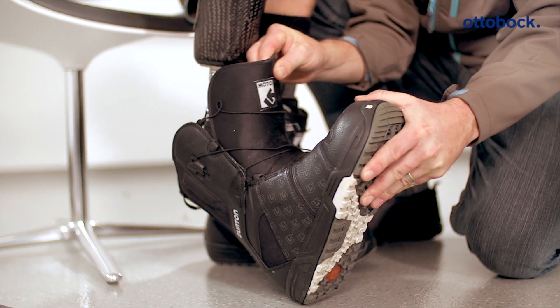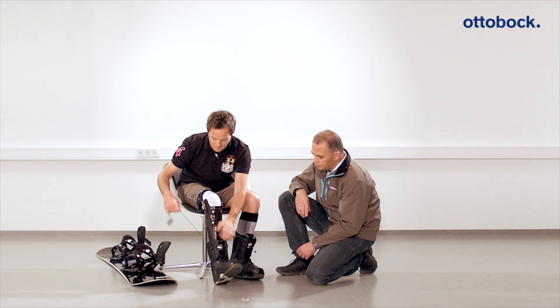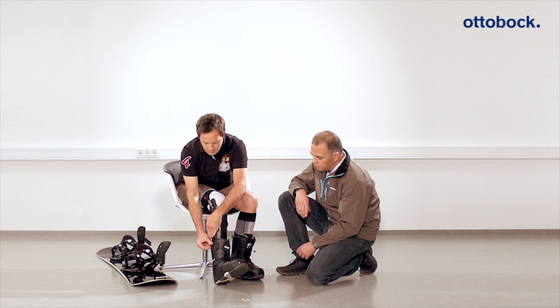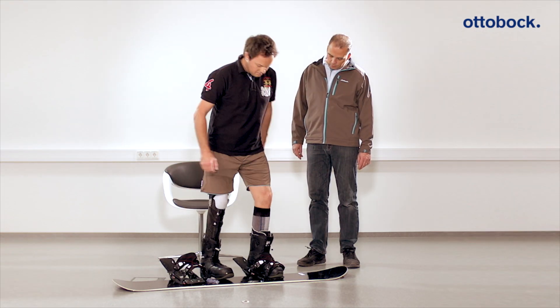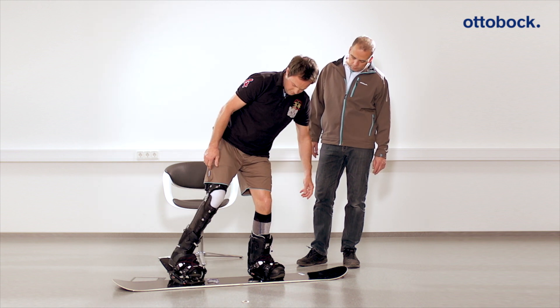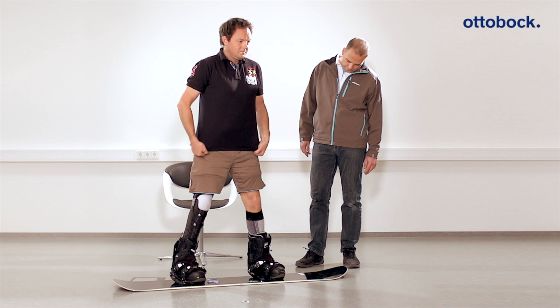If the foot shell for snowboarding does not fit in the soft boots, it can be shortened as needed. Observe the habits of the user the first time he or she steps into the snowboard binding. The patient should practice deflecting the spring for the first time, leaning the upper body forward slightly in order to get a feel for the system.